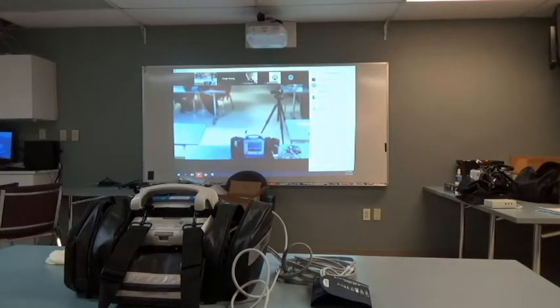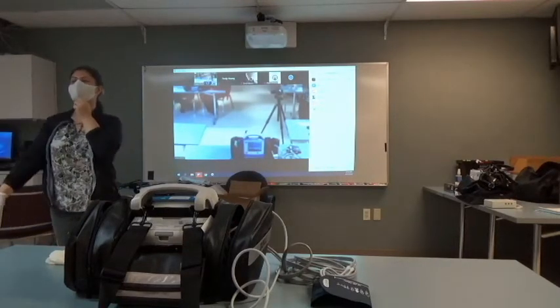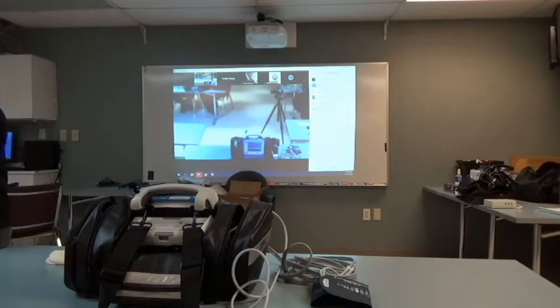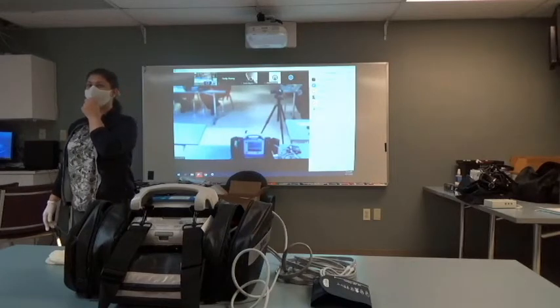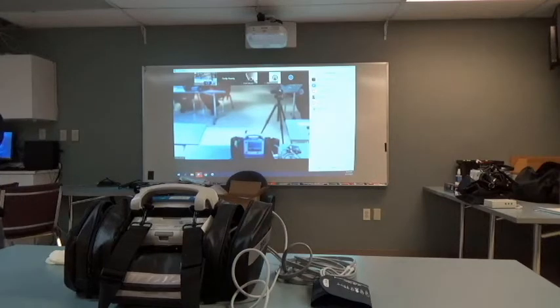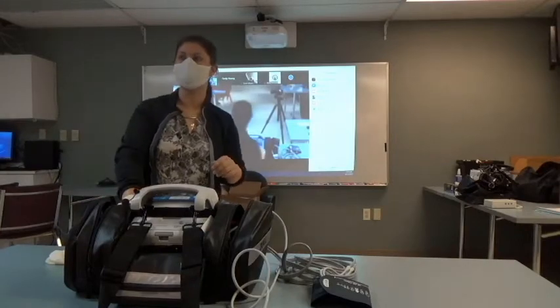Give me something you guys learned today about the blood pressure system, anything. Don't put it around your patient's neck. Don't put it around your patient's neck, fair enough, but talk to me about either the technology or sizing the cuff up. It can sometimes take it on the way up, and we can help that out by sizing the cuff up the right way. Remember, as close to bare skin as possible, line up the white artery line marker, and then make sure it's inside the goalpost there. Everybody good with the right-hand side?